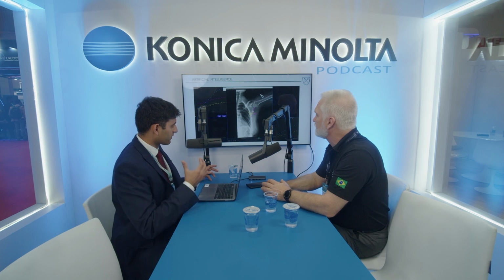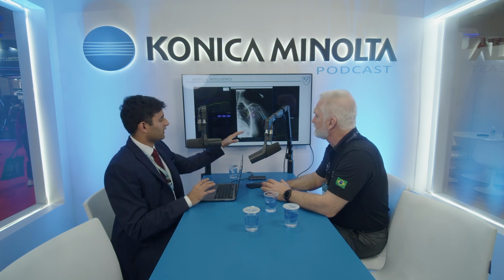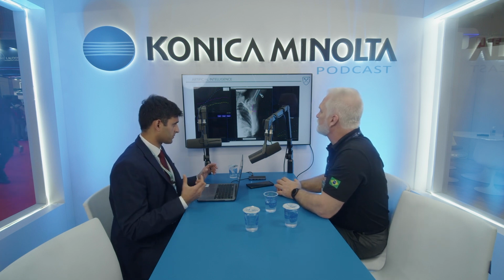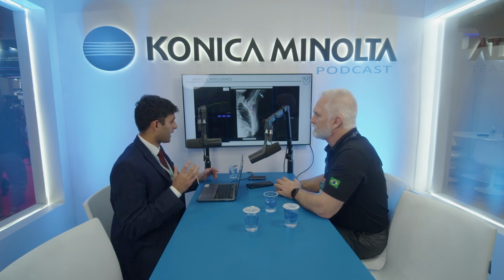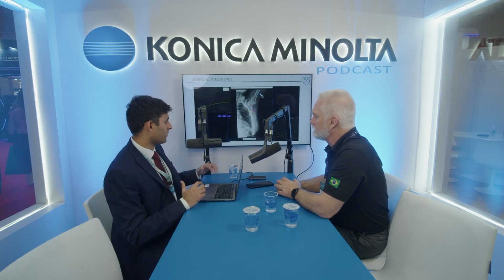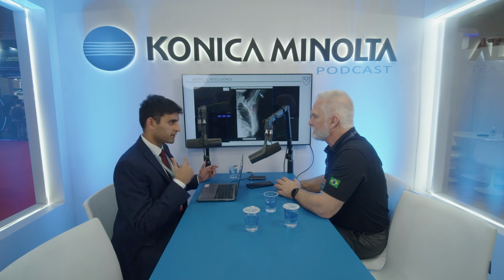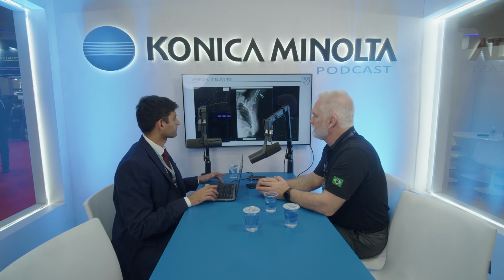And since then, we have tried to tweak the model to actually work off the lateral border of the scapula, which is more predictable in terms of its location. And we are actually working on that study right now to hopefully integrate these results, validate them, and bring them into the clinic setting to help us automate those measurements, so we do not need to individually make the measurements at every single angle. So, a lot of promise. I think this is where the future is. Still some work to be done.